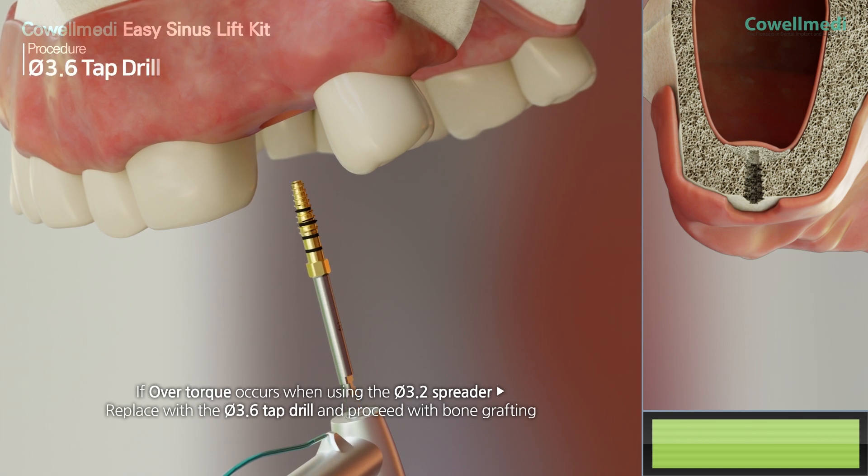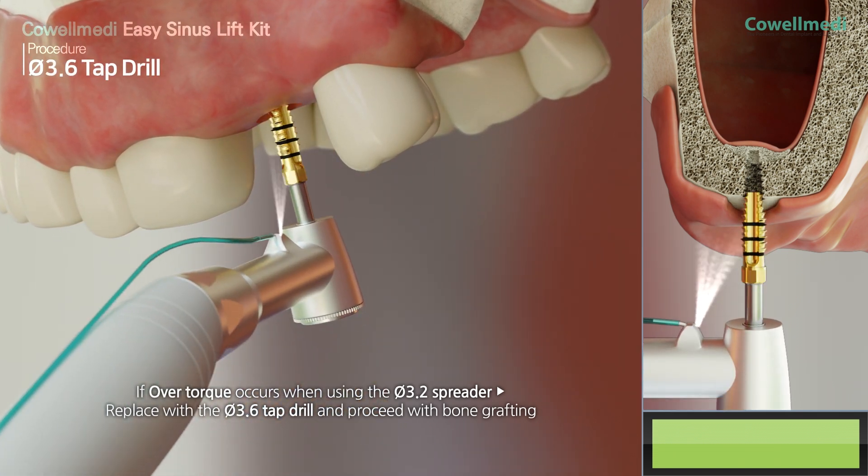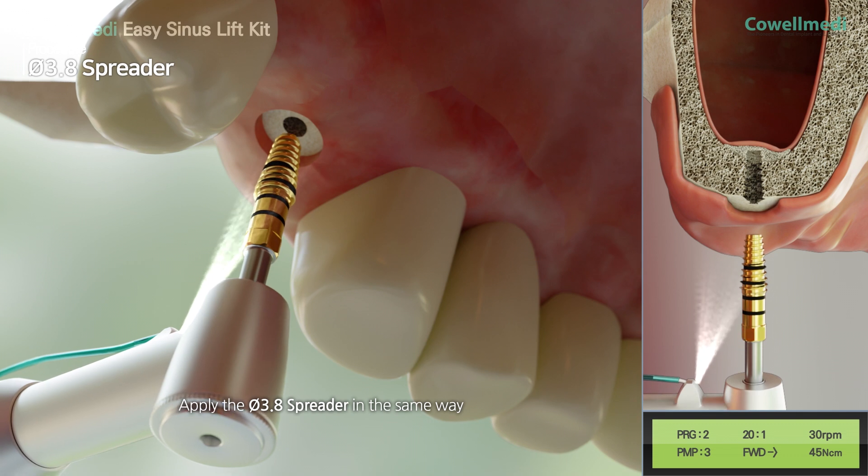If overtorque occurs when using the Ø3.2 spreader, replace it with the Ø3.6 tap drill and proceed with bone grafting. Apply the Ø3.8 spreader in the same way.